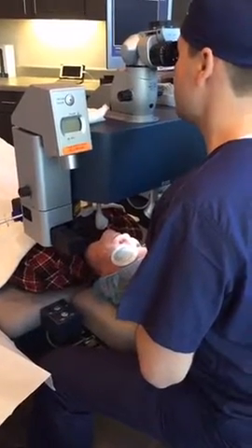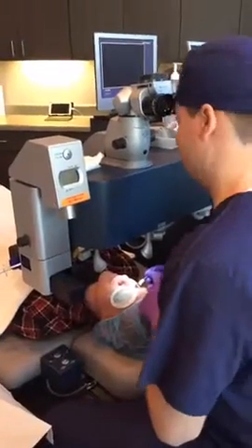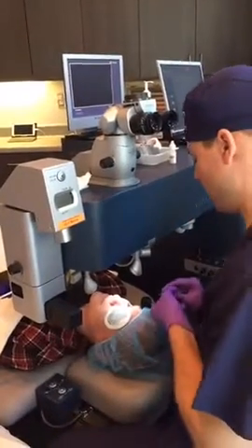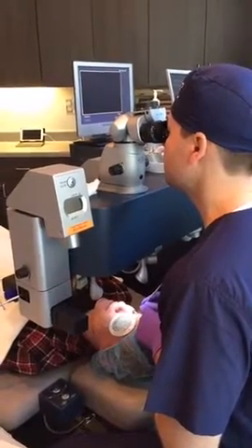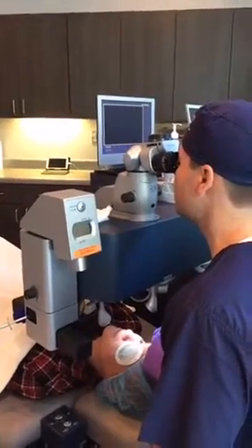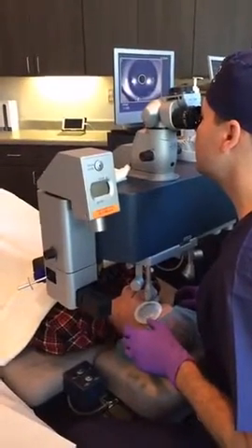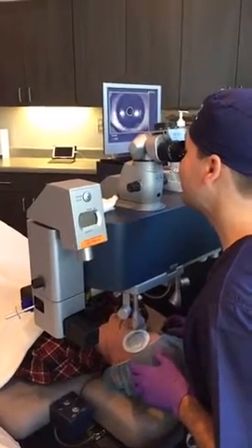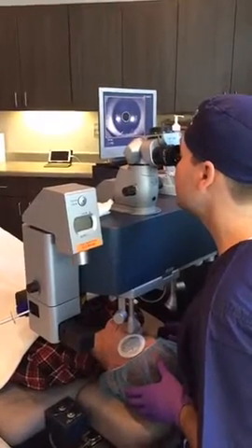Alright, so just looking straight ahead there at that green light in the middle. And you're going to feel a little bit of tug and pull here while I'm lifting the LASIK flap. This takes a few seconds. Just look straight ahead there where that green light is as best as you can. It's a little fuzzy during this step, and that's normal. This is weird. Okay, you're doing good. Just watch the green light now. Okay. You try to hold it still.